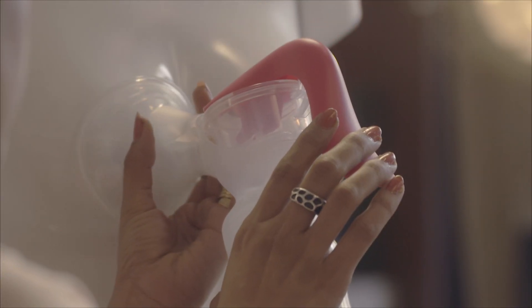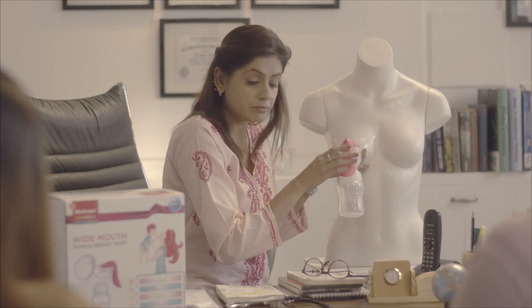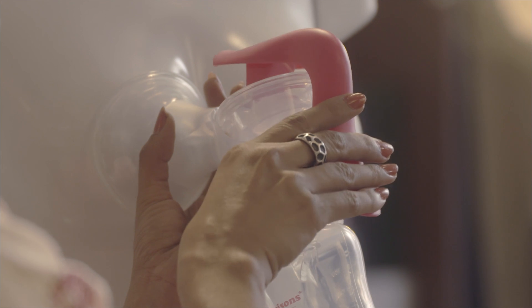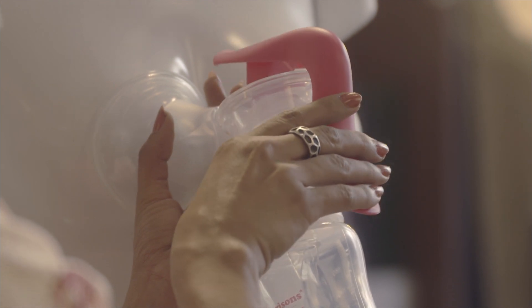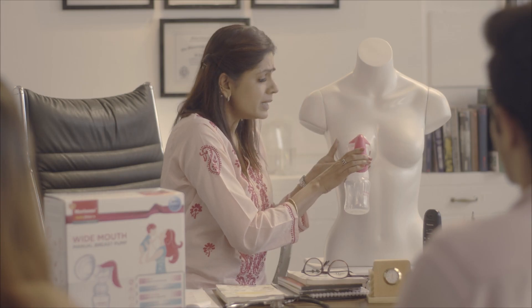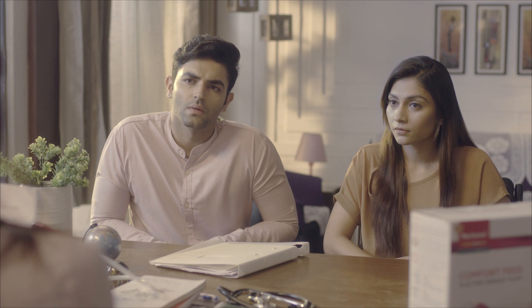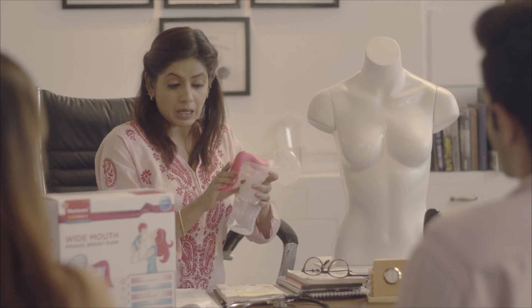Place the breast shield on the breast tightly — make sure there is no air escaping or there will be no suction. Now slowly and gradually press the handle without rushing, in a rhythmic way. It might take a little time, but be patient. When you think you're done and milk has stopped coming, remove the breast pump.